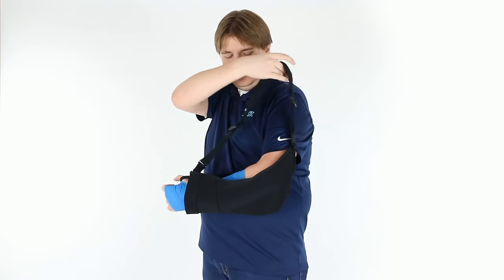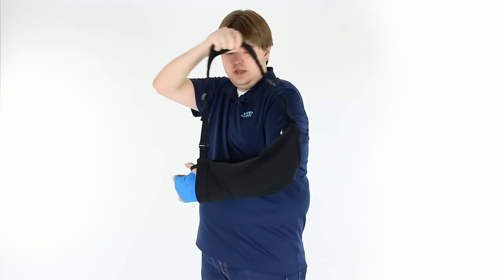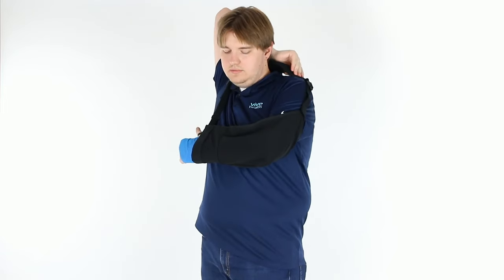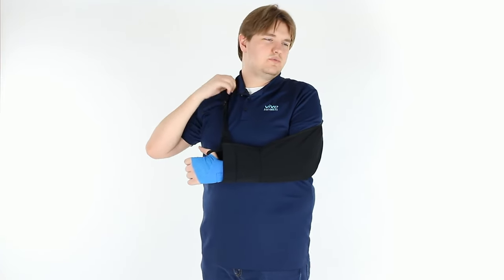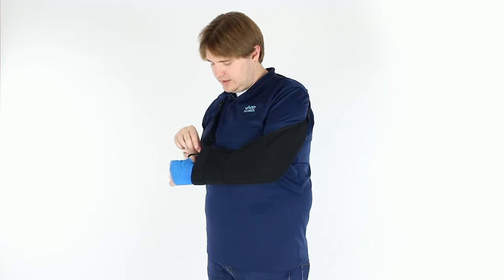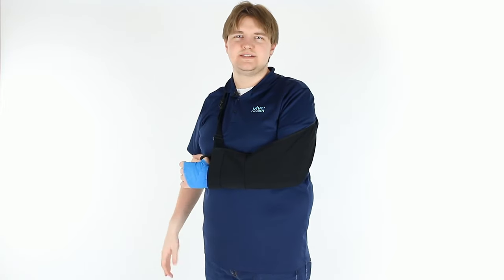Pull the sling up so that your elbow is cradled properly. Bring the strap up and over your head. Make sure the cushion is properly fitted against your neck. You can adjust the straps on either side, either in the front or back. Make sure everything is comfortable, and it's as easy as that.